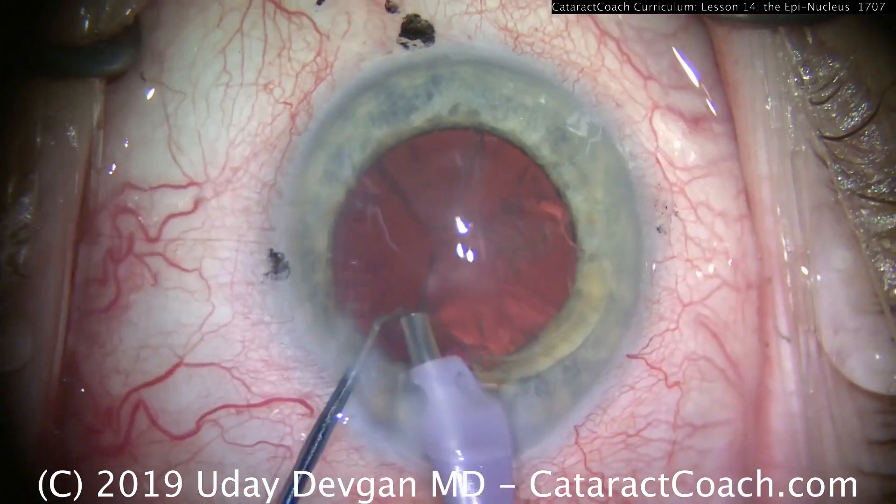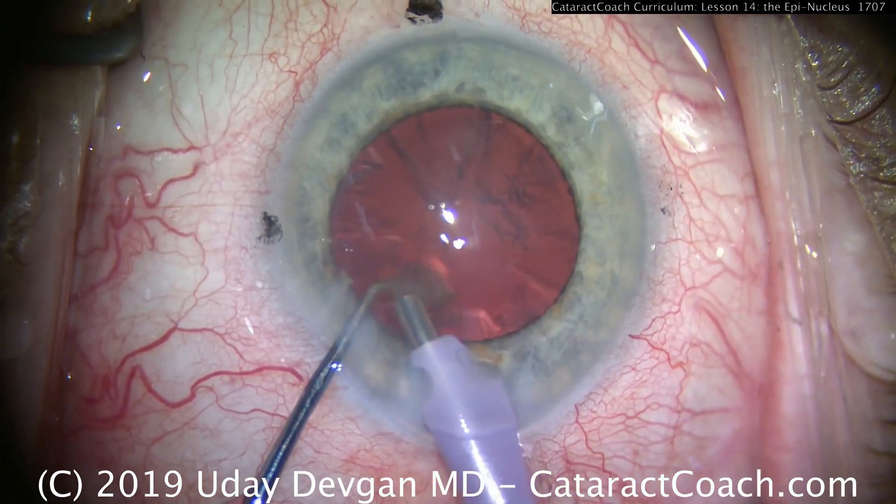We want to stay away from the posterior capsule. Look at the chopper position to protect.